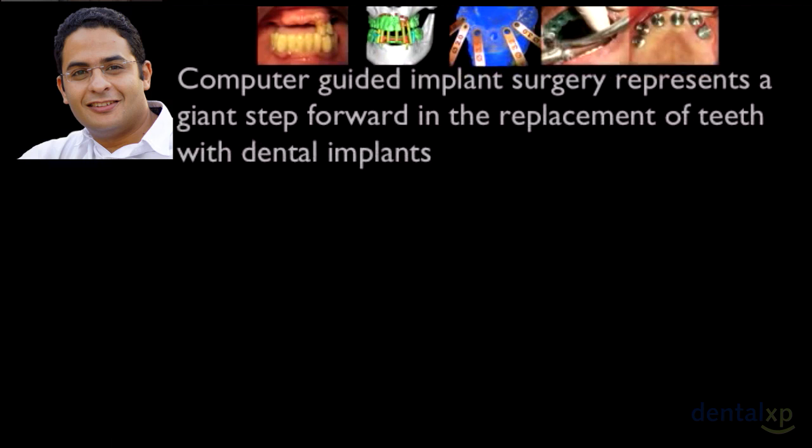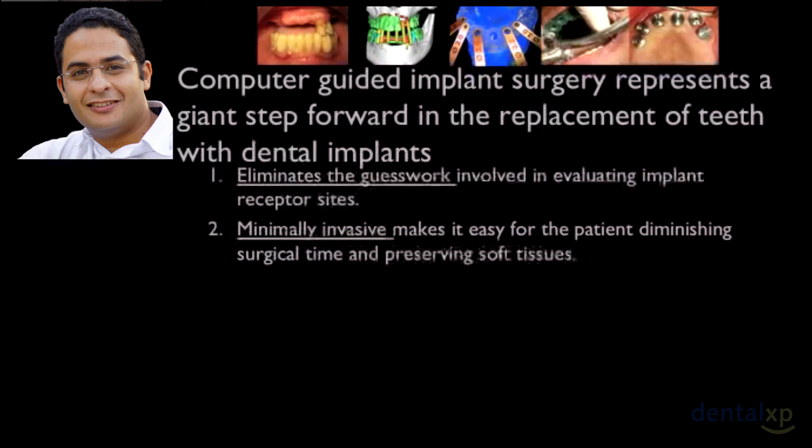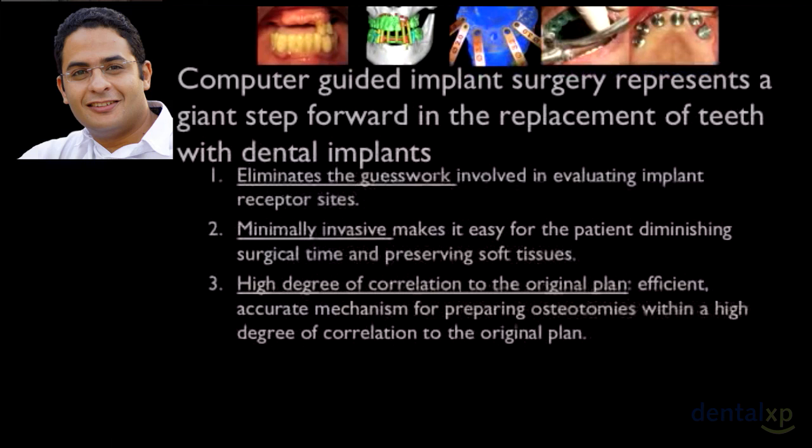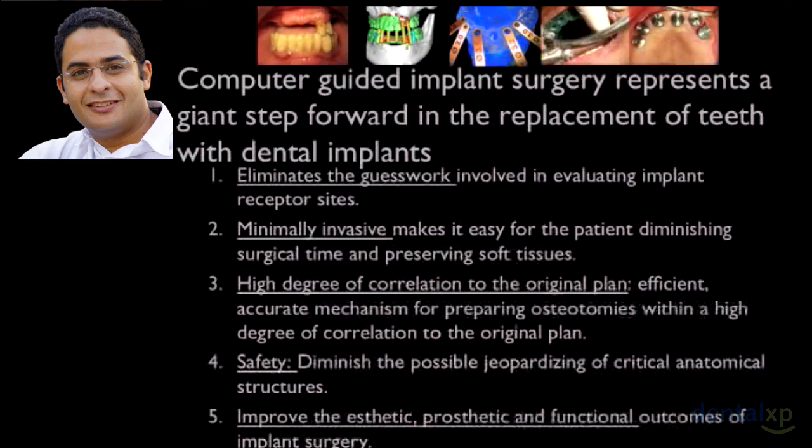Also, computer-guided implant surgery represents a giant step forward in the placement of dental implants, eliminating the guesswork in evaluating the receptor sites, minimally invasive, easier for the patient, diminishing the surgical time, high degree of correlation to the original plan, safety, and improved aesthetic, prosthetic, and functional outcomes of implant surgery.